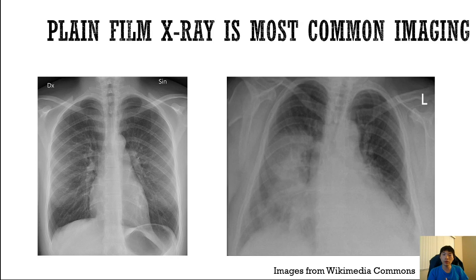So it takes quite a lot of training, a lot of patience, and a lot of experience for radiologists to interpret and read these plain film X-rays. So let's think about what we can do in terms of imaging technology in order to create 3-dimensional images and make it easier for us to interpret where the fluid is in the lungs.